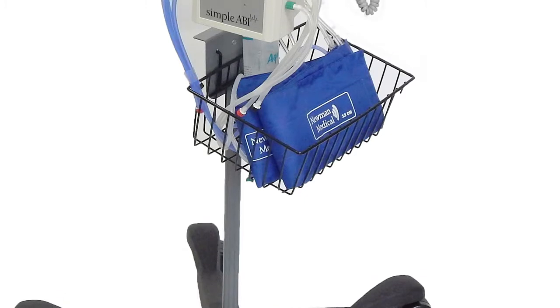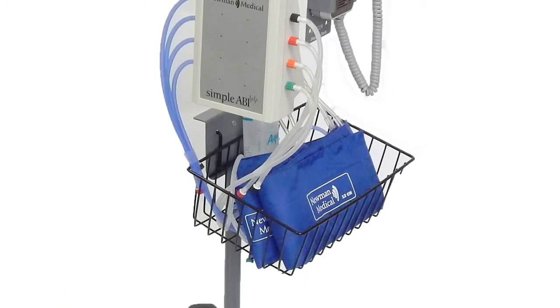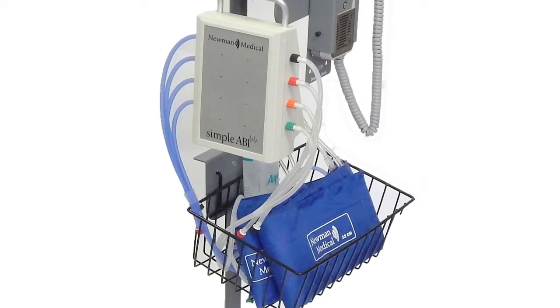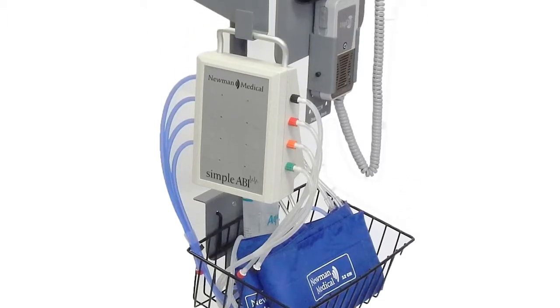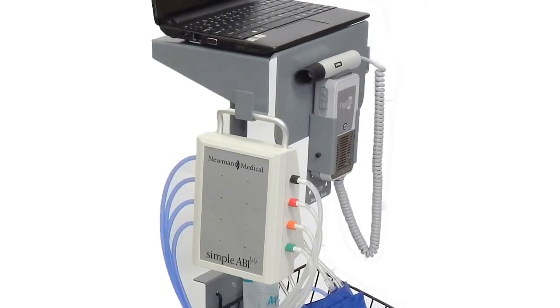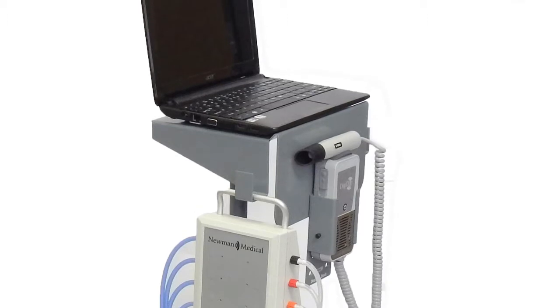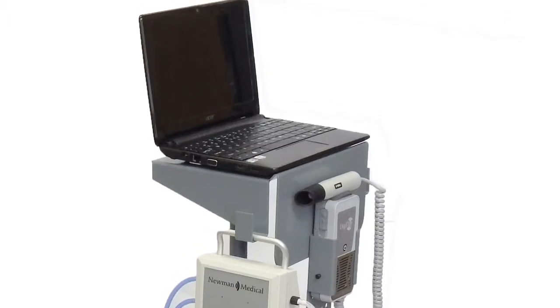Simple ABI systems assist in performing this test quickly and accurately, following the clinical and CPT recommendations for the ABI exam. These recommendations include obtaining the systolic pressures using a Doppler at both the PT and DP arteries at the ankle, and including a Pulse Volume Recording, or PVR, waveform at the ankles.